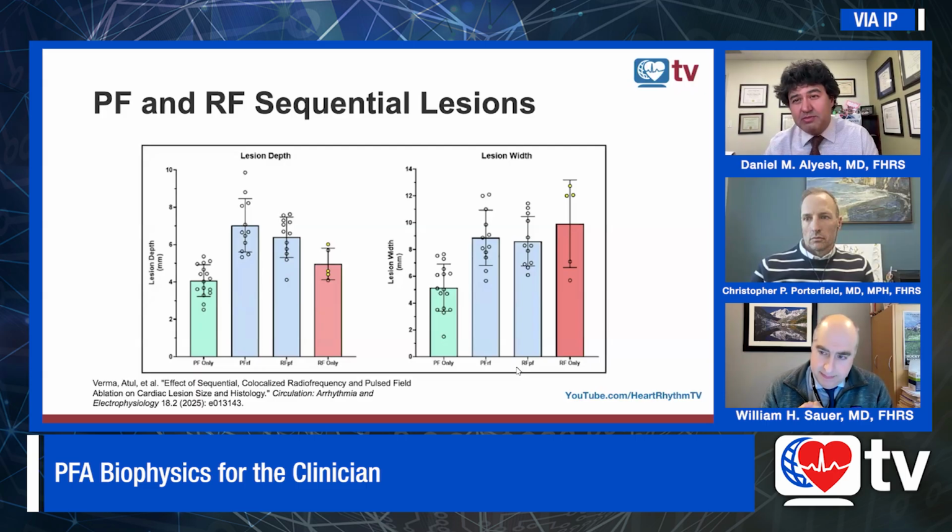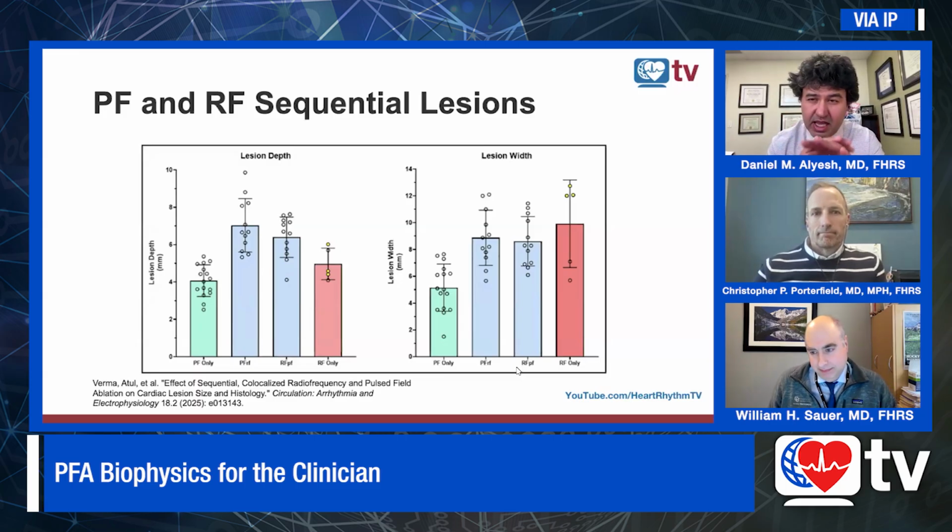No, I think this is what I found very interesting about this too: the center of the lesion appeared to be coagulative necrosis, so more thermal, and then the rim was more hyperemic, and more of a PFA type lesion. So the argument is your center is going to be more thermal, and then the outer rim, you may still have the safety of PFA, although this was only a few pigs in the ventricle. Really a lot more to learn in this space, but I think you're right. The ventricle, we need to get deeper. The atrium, I think there are areas where there are challenging substrates and we're limited, but for pulmonary vein isolation, we have a fairly good early algorithm there.